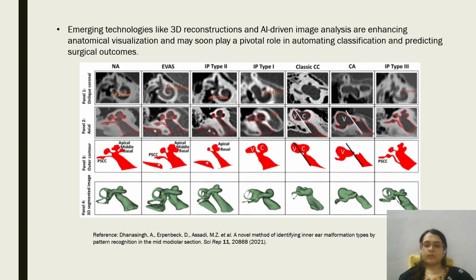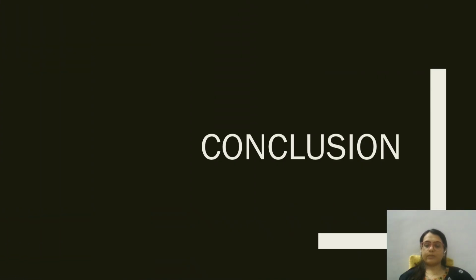Newer modalities have emerged like 3D reconstruction and AI-driven image analysis, which helps in automating classification and predicting surgical outcomes. Conclusion.